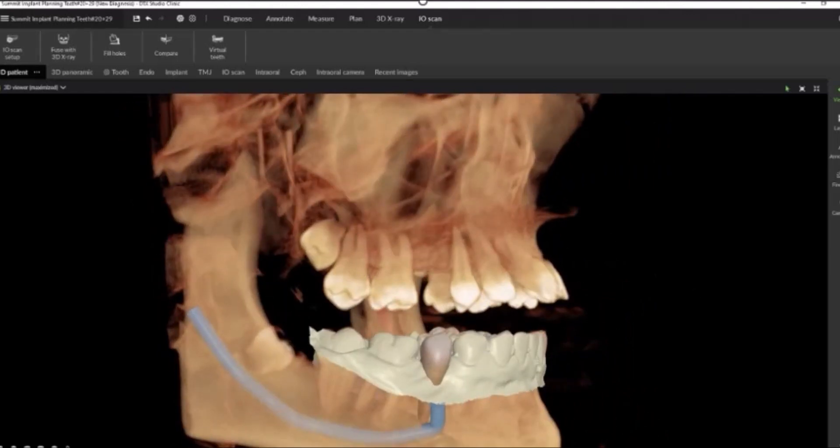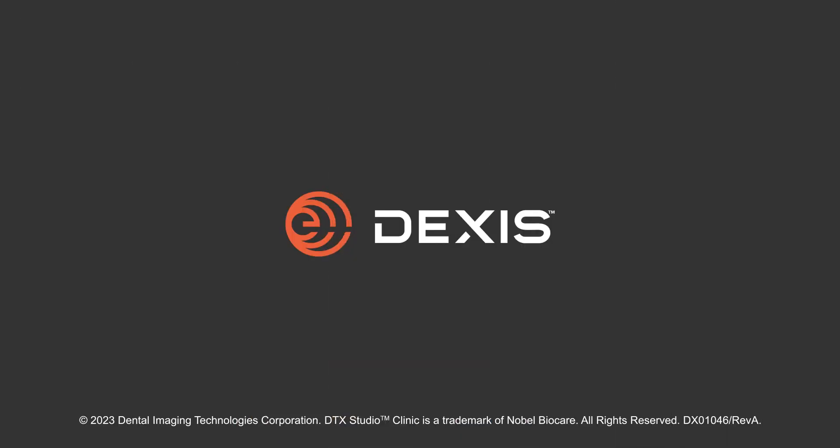There will be no adjusting necessary and we can go straight into placing our implant. Because of our AI and smart simplicity, DTX Studio software can go from opening a case and in less than 10 clicks, you can place an implant. This includes orienting the patient, mapping the nerve, merging data sets, and creating restorations for crown down implant planning.